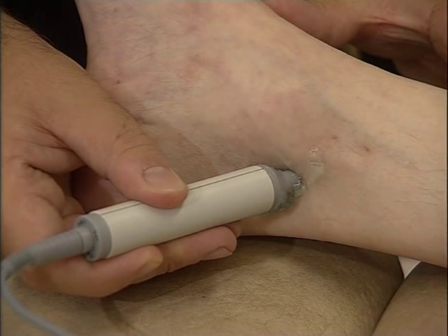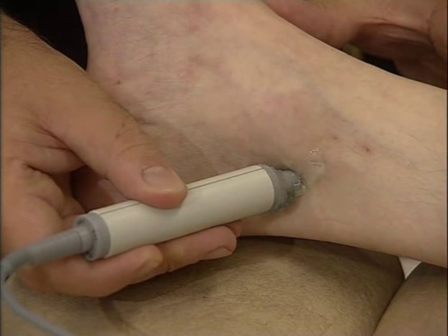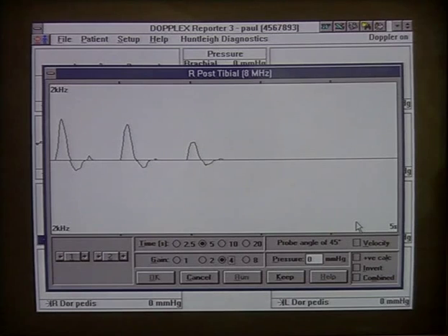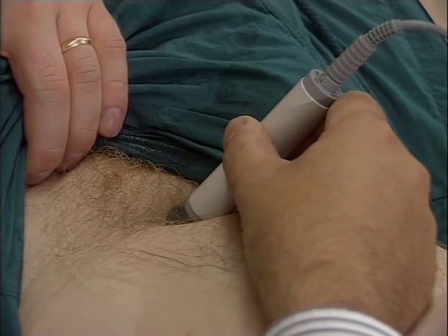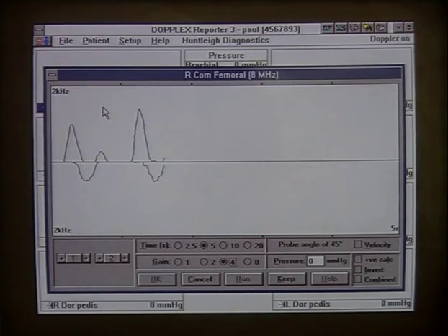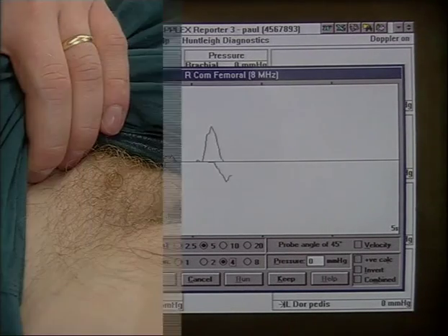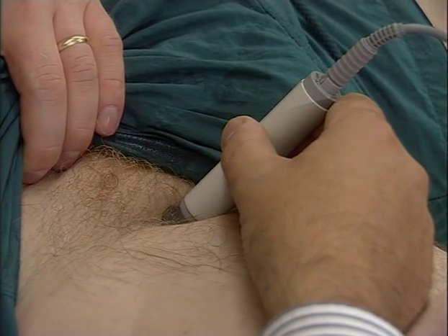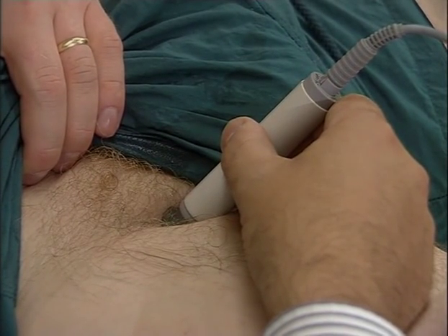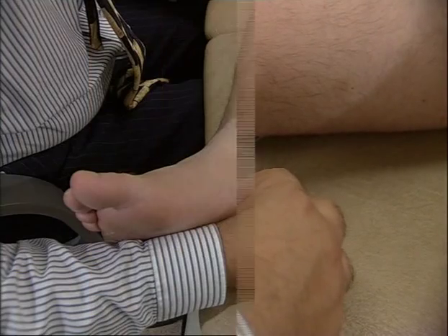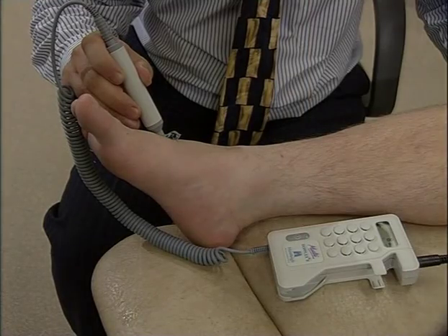To detect arterial blood flow, use a five or eight megahertz probe. Adjust the gain to optimize the height of the waveform. The angle of the probe to the vessel will also affect the height of the waveform. Looking first at normal signals and waveforms, four main arterial sites are examined: the common femoral, popliteal, posterior tibial, and the dorsalis pedis.